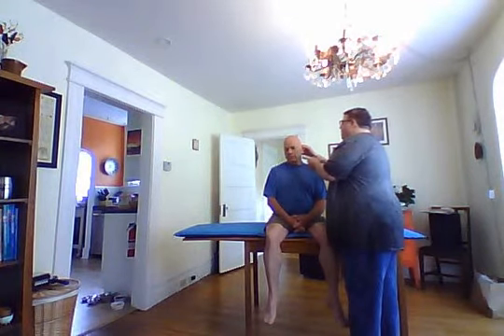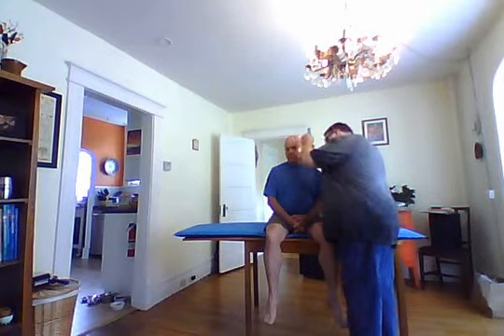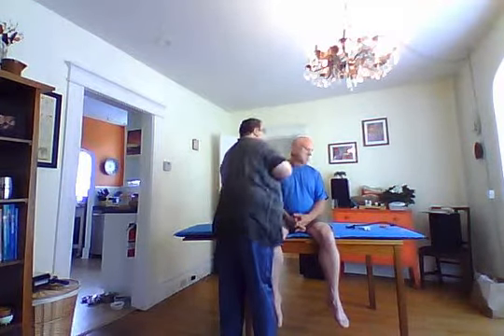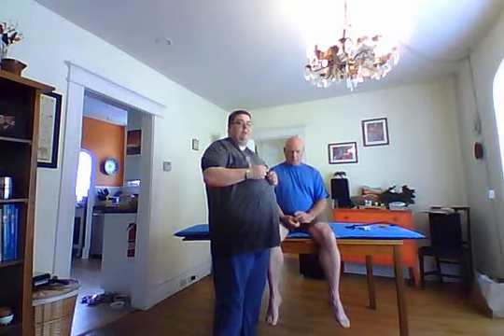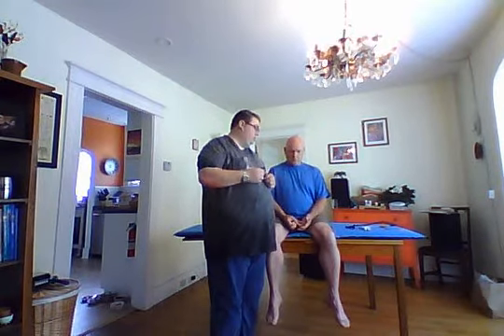I'm now going to use my otoscope with the largest speculum I can use to fit in the ear without causing discomfort and still visualize. Pulling the pinna up and back, inserting 1 to 1.5 centimeters, looking at the external canal and middle ear. The external canal, I do not see any foreign bodies. It's pink. There is minimal cerumen and there is no erythema. The middle ear, his tympanic membrane was pearly gray, translucent, with no bulges or perforations.